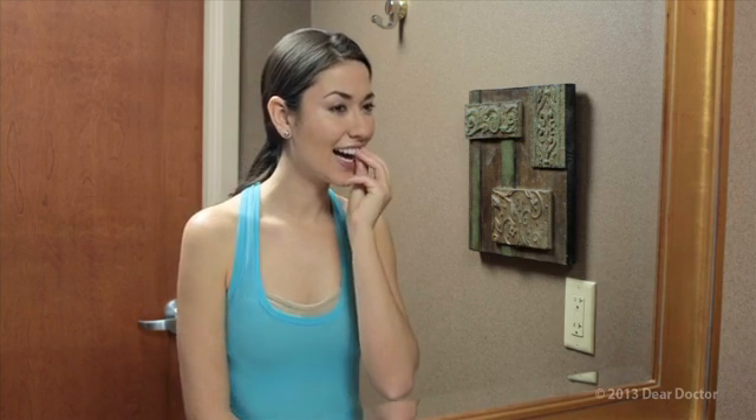Total treatment time will generally range from 6 to 24 months. At this point, your dentist will fit you with a retainer, just as you would wear after any other type of orthodontic treatment.